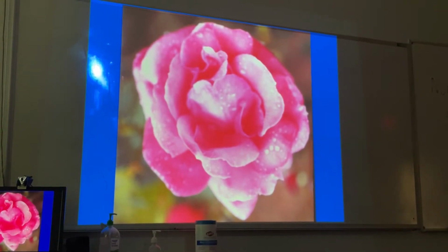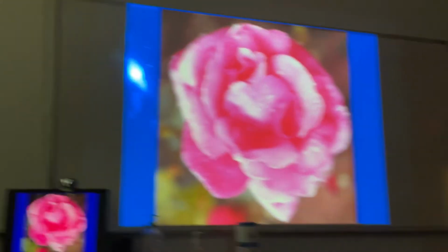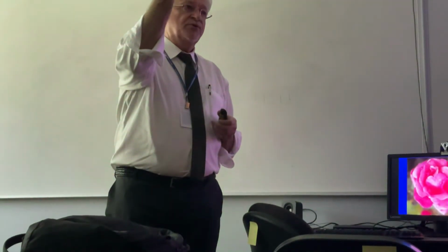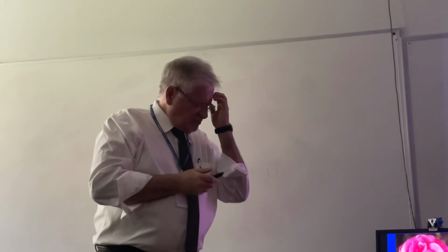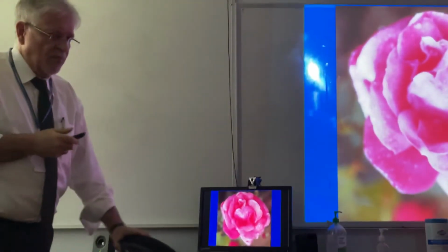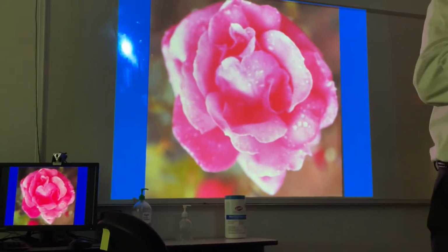Questions on wrist? Straightforward, right? Hand, central ray goes where? The third metacarpal. Third metacarpal. Okay. All right. Anything else for me? The shortest wrist lecture I've ever given. Wrist and, yeah, not hand, but just wrist.